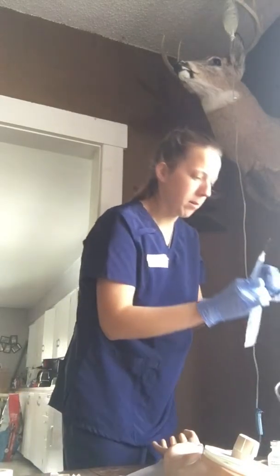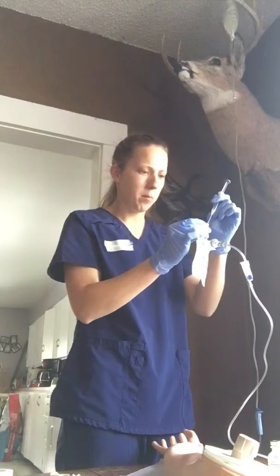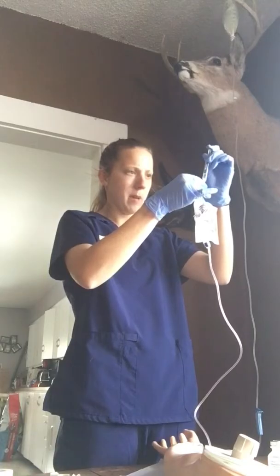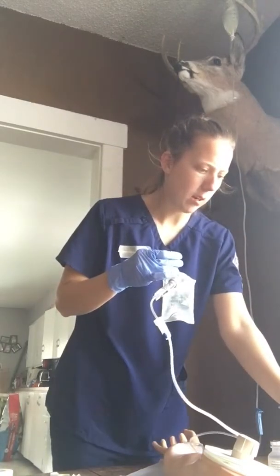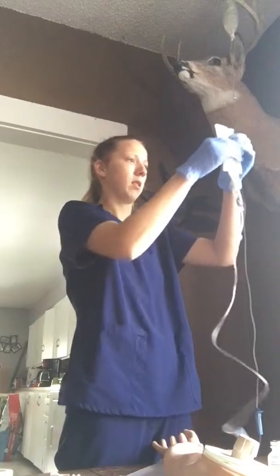Then we're going to take an alcohol swab and clean the port here — just an extra precaution. I'm going to put the syringe in the port and inject the medication into our bag. Then I'll dispose of the syringe into our sharps container.